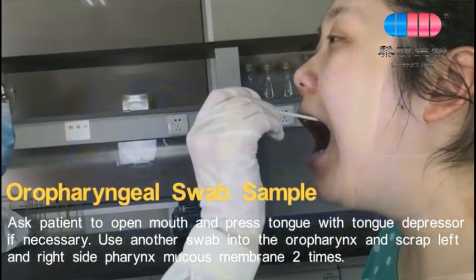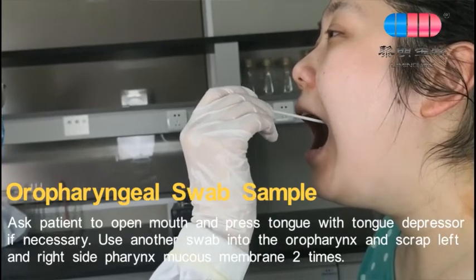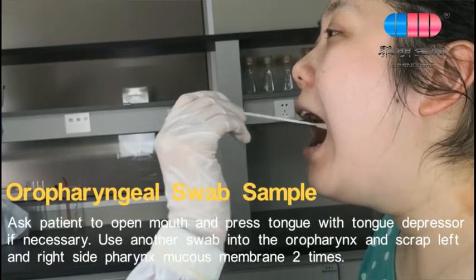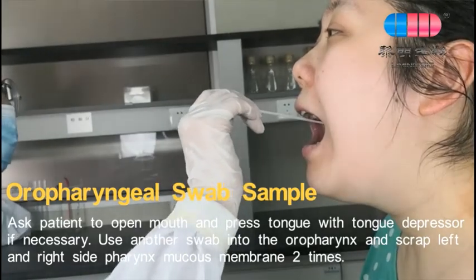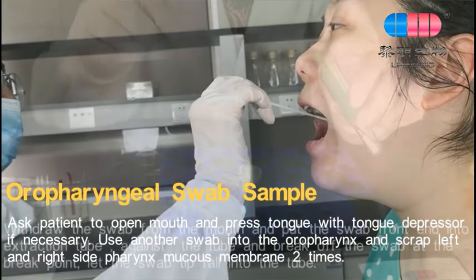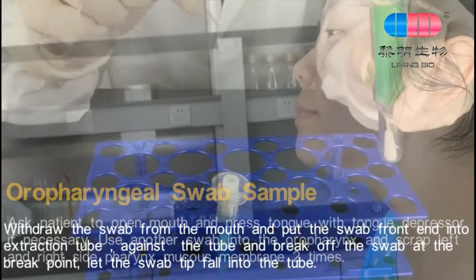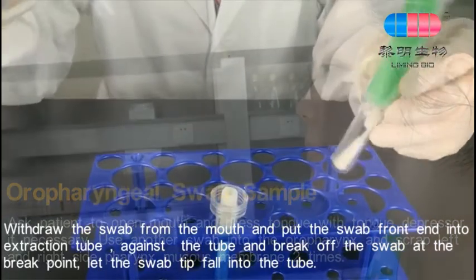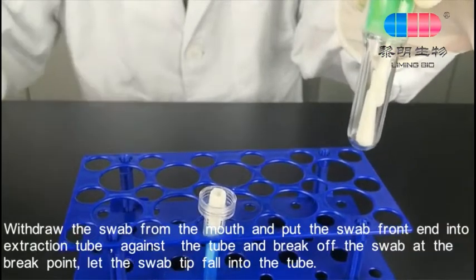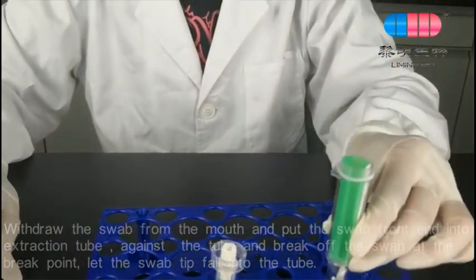For an oropharyngeal swab sample, ask the patient to open their mouth and press the tongue with a tongue depressor if necessary. Use another swab into the oropharynx and scrape the left and right side pharynx mucous membrane two times. Withdraw the swab from the mouth, pull the swab front end into the extraction tube against the tube, and break off the swab at the break point. Let the swab tip fall into the tube.